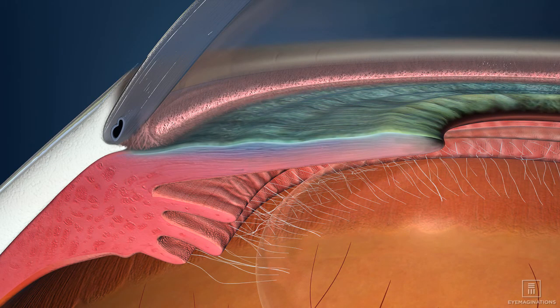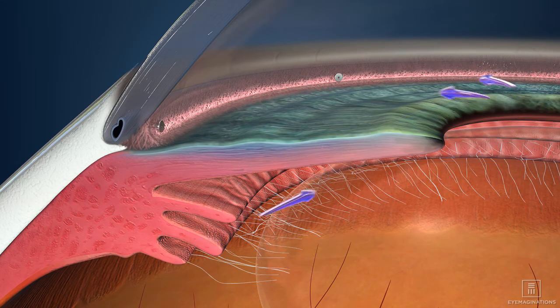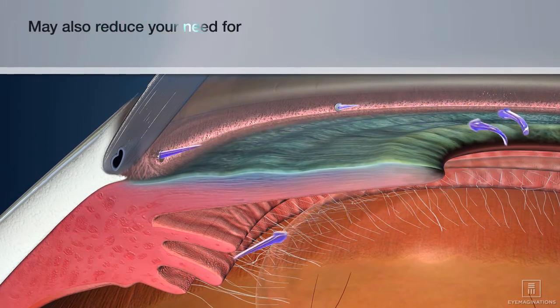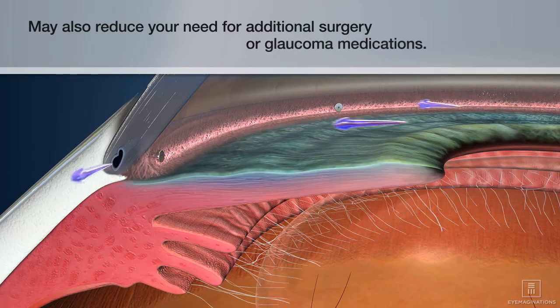The Eye Stent Inject system does this by creating tiny channels to allow fluid to drain from the eye. The device may also reduce your need for additional surgery or glaucoma medications.